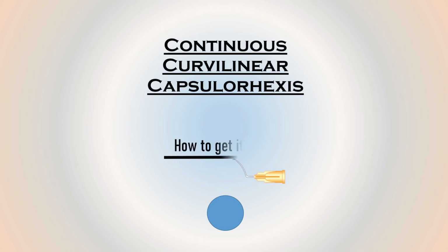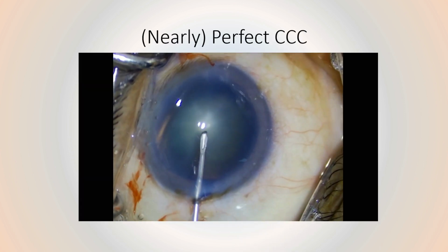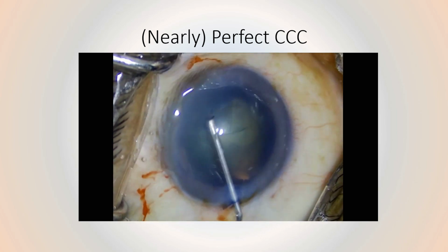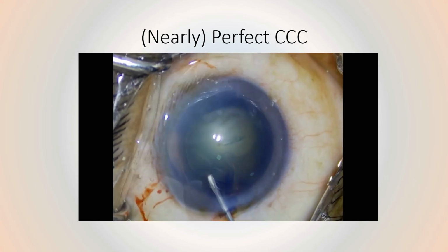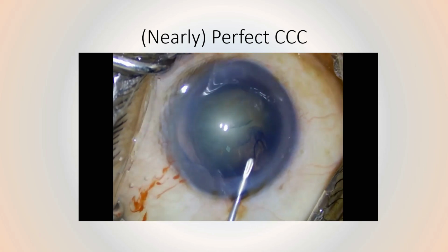Continuous curvilinear capsulorhexis. How to get it right? Nearly every time. A nearly perfect CCC looks something like this. There we start with a nice raised flap, move curvilinearly with shearing forces, and then end with a nearly perfect circle.